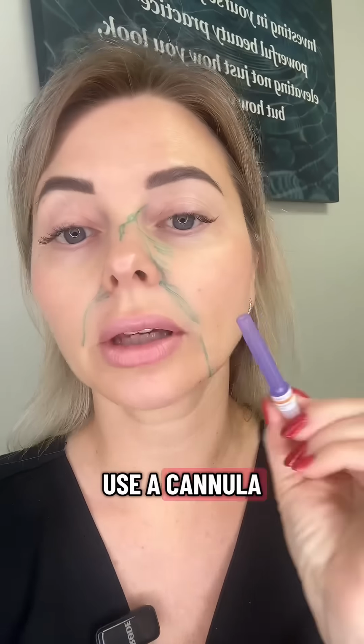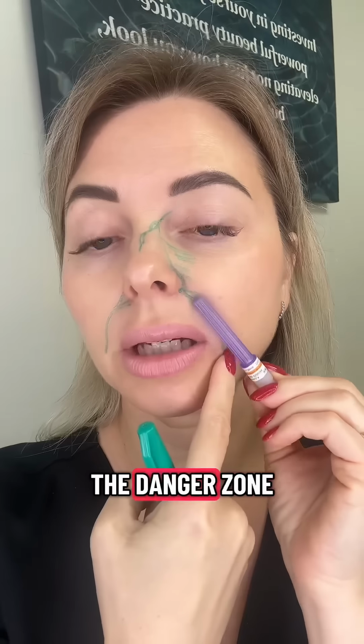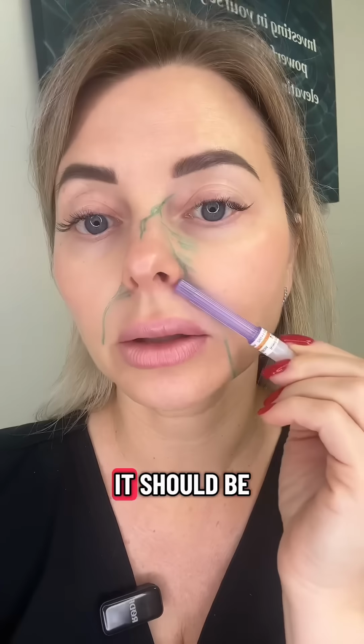Last but not least, you can use a cannula, and your place of introduction will be far below the danger zone. So when you are here by the nose, as long as you're not overfilling this spot, it should also be pretty safe.